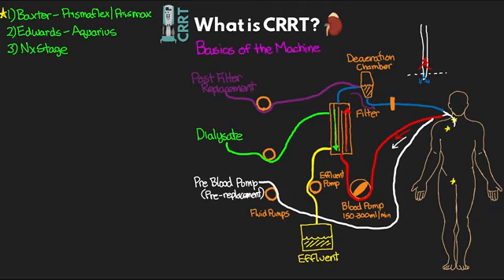Now, when we talk about these different replacement fluids and the dialysate, there are many different types of solution that we can use for these fluids.